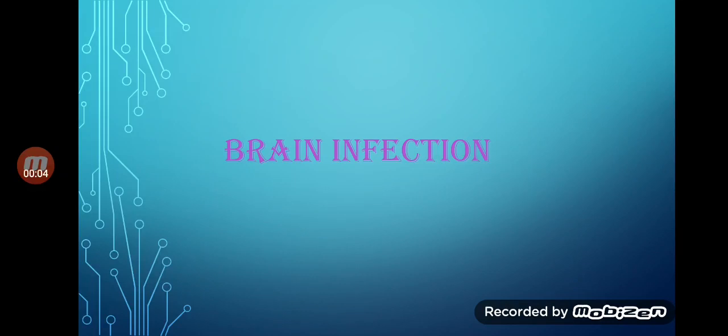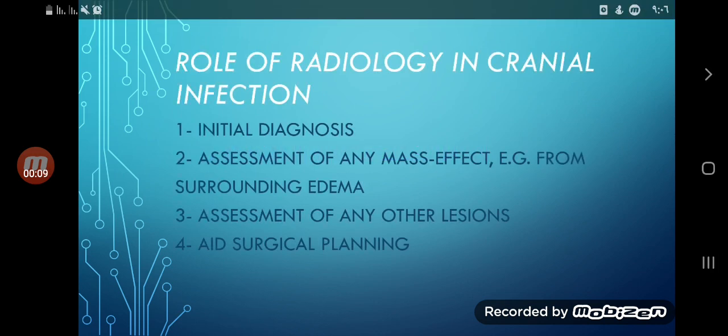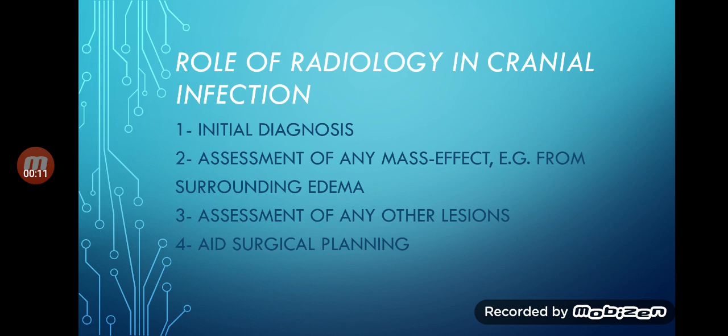This video, I will explain the lecture on brain infection. The role of radiology in cranial infection is, first, initial diagnosis. You can help in initial diagnosis.